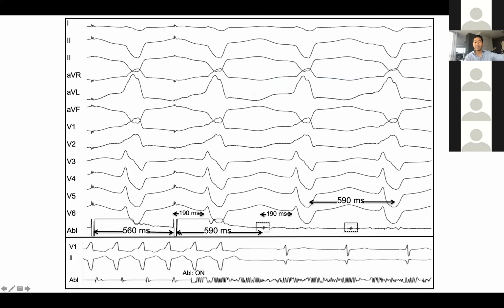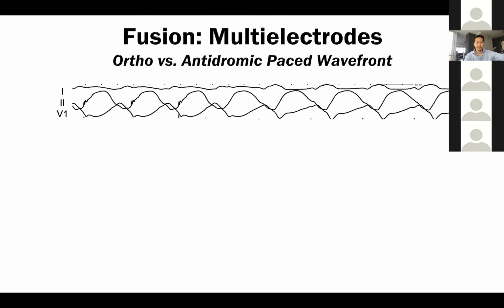Let's now look at the PPI, 590, TCL, 590. Checkpoint 2, 3, stim to QRS, EGM to QRS. Here's my pacing to my QRS onset is 190. My EGM, what I'm recording to here, also 190, perfect. 3 out of 3 on your boards that Brad helps a lot with. They will give you a perfect one here as well and just have you circle, is this a good spot? Perfect, keep going, not. But this is perfection in terms of the 3 criteria.